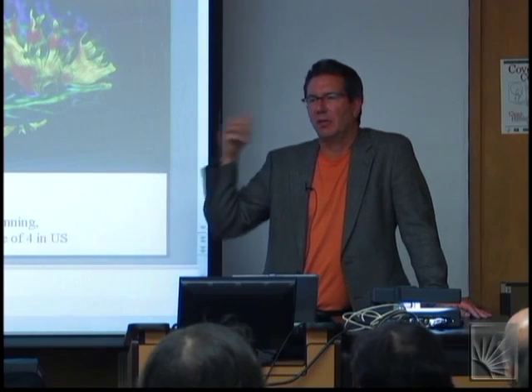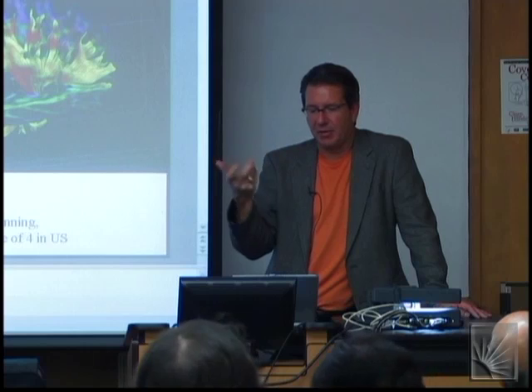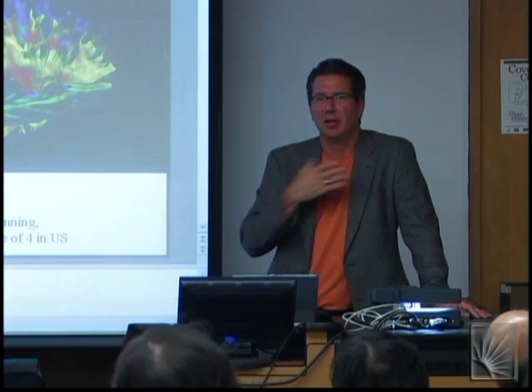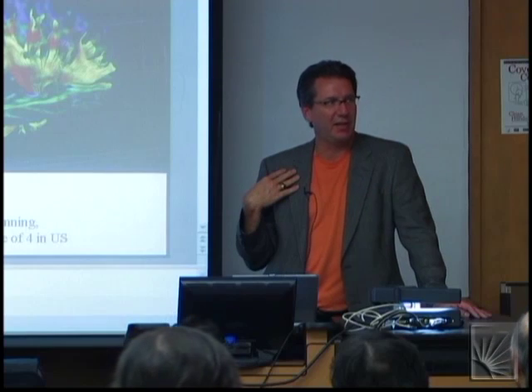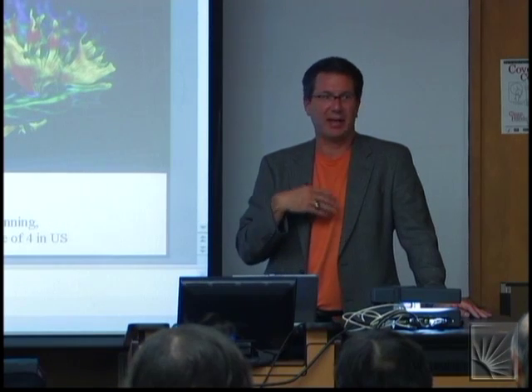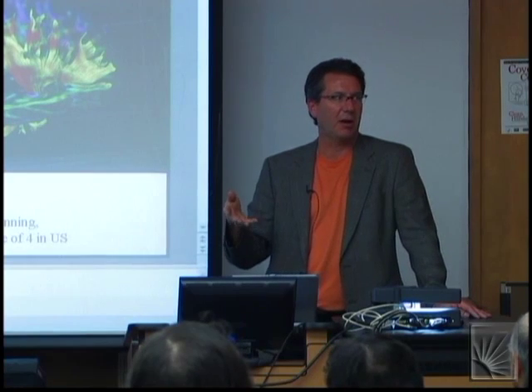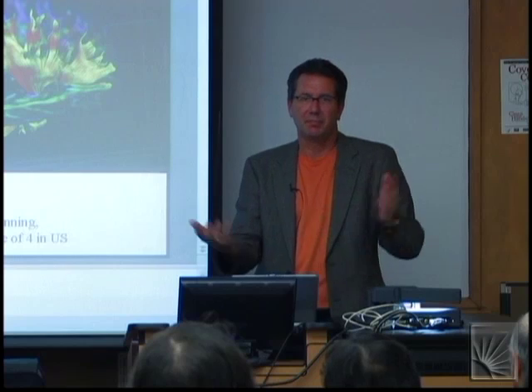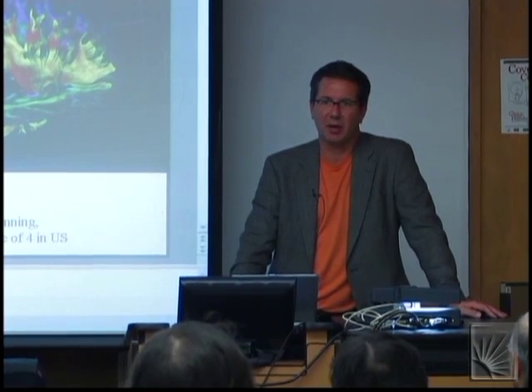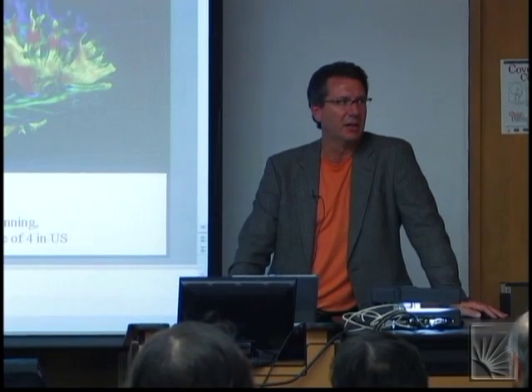There are other applications too, like the one example that we had here, an acquisition that showed that beating heart. That's done in real time, so we don't have to hook ECG leads up to the patient. The patient doesn't have to hold their breath. People who are sick can't hold their breath at all. If you get a patient with congestive heart failure, with oxygen saturation of 70 to 80% in their blood, they can't hold their breath, so normally you couldn't even do a cardiac MR scan.